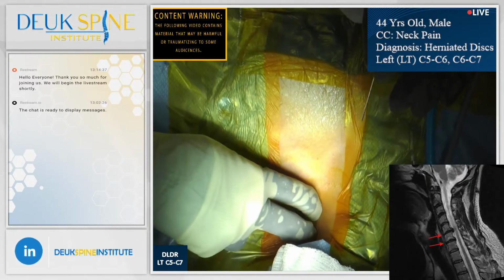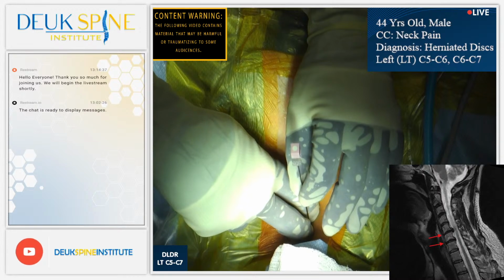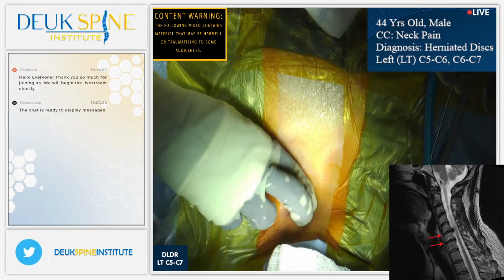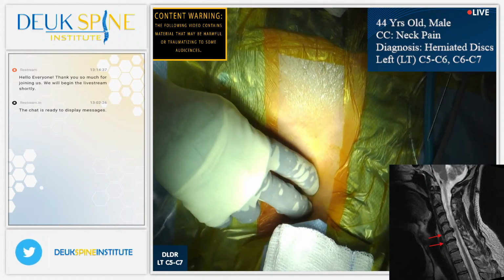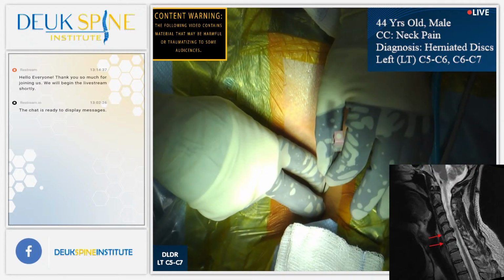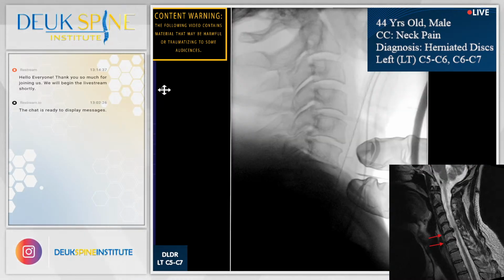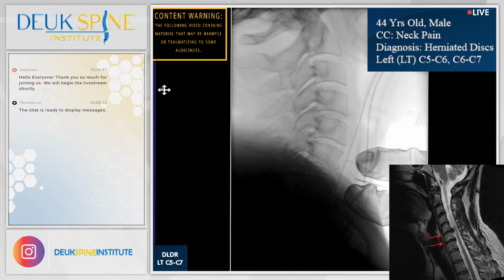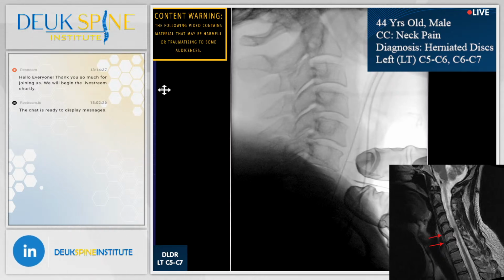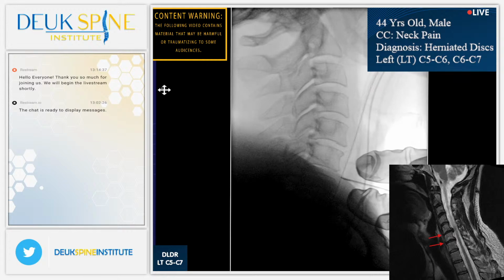So the first thing I'm going to do is place my needle. It's a little tight. All right, 2, 3, 4, 5, 6, 7. So I want to be a little bit lower. I'm going to try to start at 6, 7. How much time do we need? Oh, I should be fine now. It feels better already. Shot. All right, so I'm going to move south. Shot. Everyone agrees that's 6, 7, 2, 3, 4, 5, 6, 7, yes? Yes. All right, shot. I'm going to go in. Shot. Shot. AP quick.